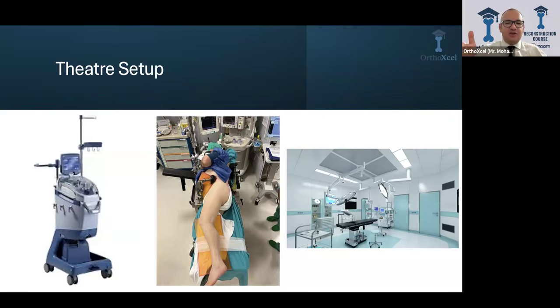Ideal to have your pelvis squared on the table, so everything is built on a squared pelvis. But some surgeons prefer otherwise, especially surgeons who are doing anterolateral; they aim to have the pelvis a bit tilted posteriorly. But it needs the surgeon himself to tilt the pelvis this way so he understands where the start point is. So when he plans his surgery or steps inside the surgery, he understands where he started from.